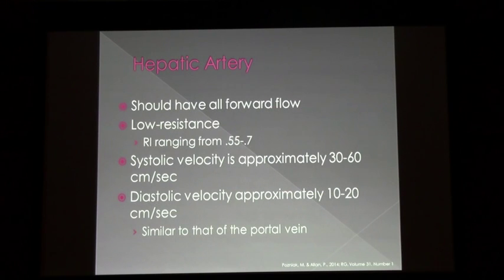So, for the hepatic artery then, for the velocity, are we supposed to be watching it? Because like she said, I did watch it once and I said something to her and they said, oh no, that's normal, when I thought it was really high, but I think it was on a younger person. Yes, get the velocity in there. If you see a high velocity, you should look and say, am I seeing a culprit lesion that's causing this? Do I have a stenosis in line that's causing this velocity to be high?